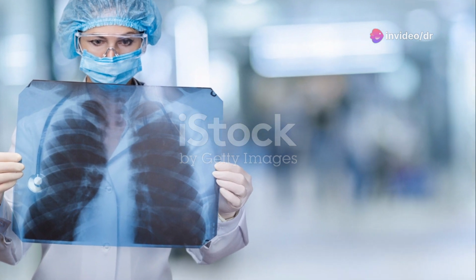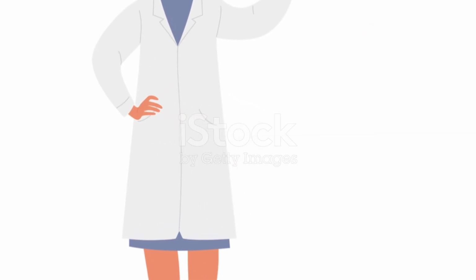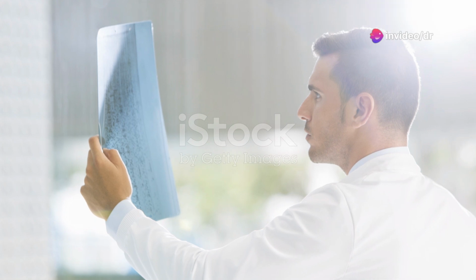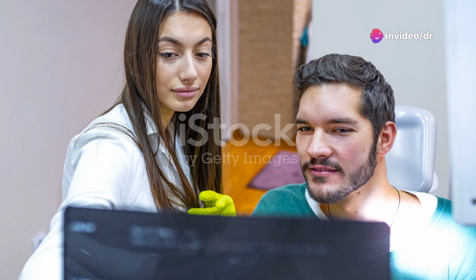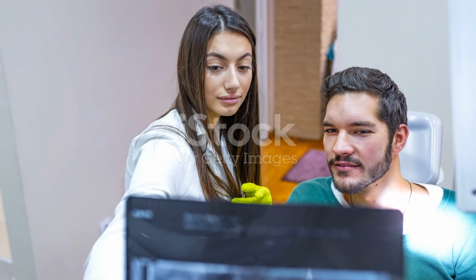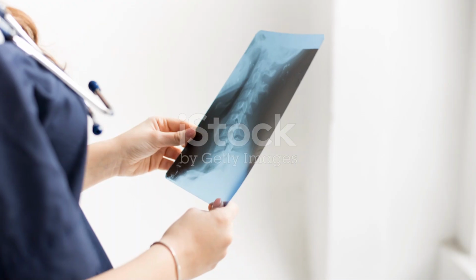In your future careers as healthcare providers, being adept at reading these signs on an X-ray will be invaluable. Not only will it aid in the timely and correct treatment of TB, but it will also help in preventing its spread, considering how contagious the disease can be. So, keep practicing, keep learning, and remember, every X-ray tells a story. Understanding that story through images is a powerful tool in medical diagnostics.